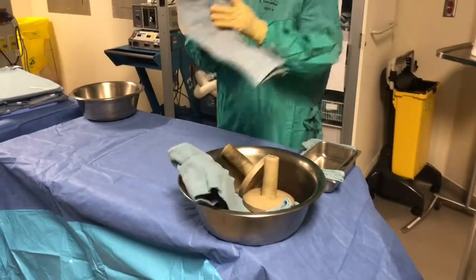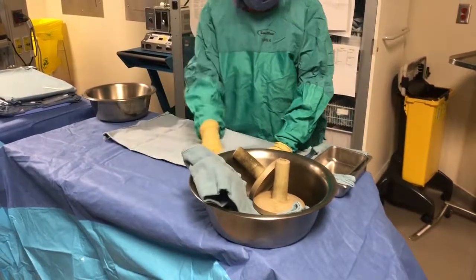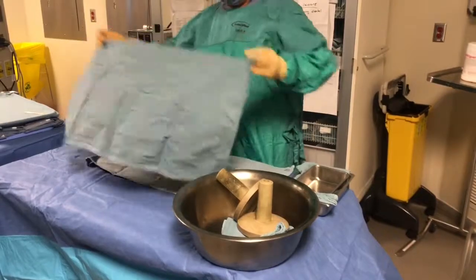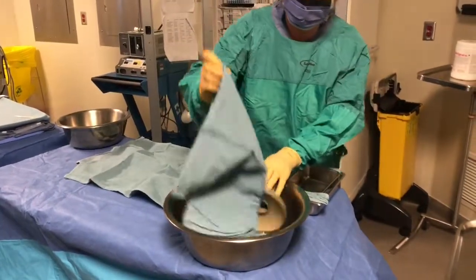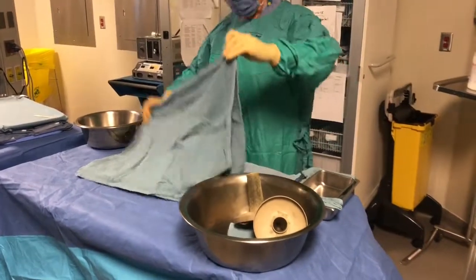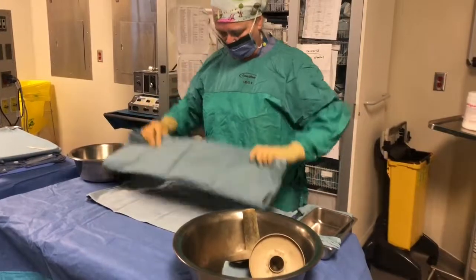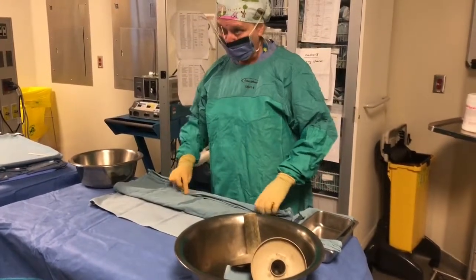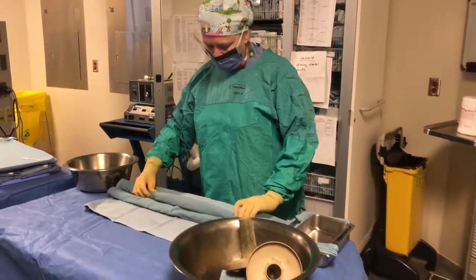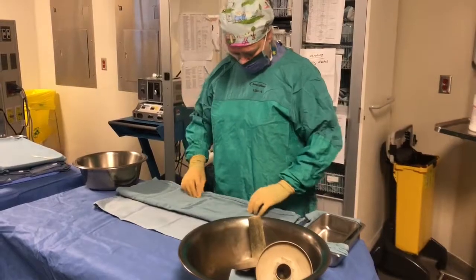So I need, because it's a full setup, I need one for the bottom. I need two more for a roll, because it's a large roll. I may surprise you and just have you set up a minor. Yeah. You never know. You just never know. Okay, and then roll. Nice tight roll. Right, and don't do this.